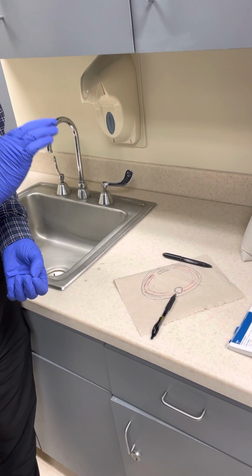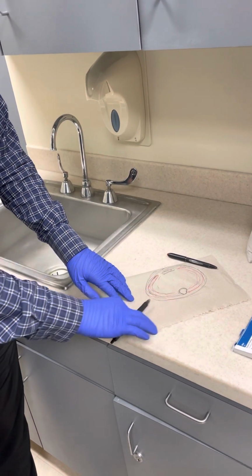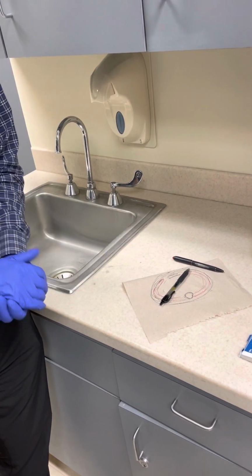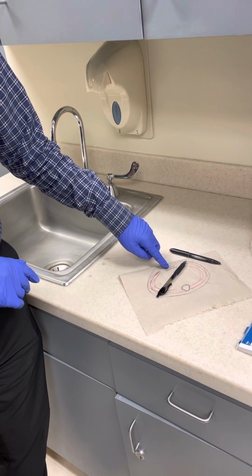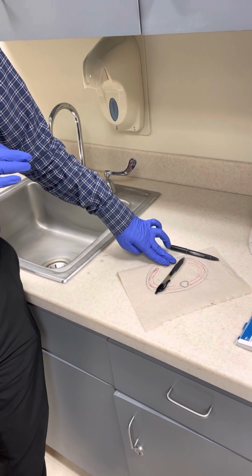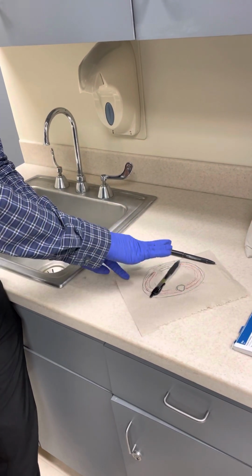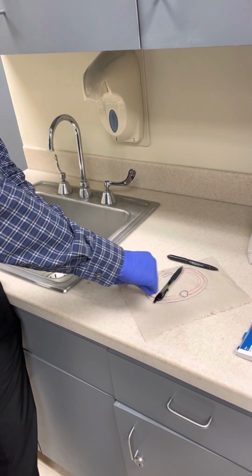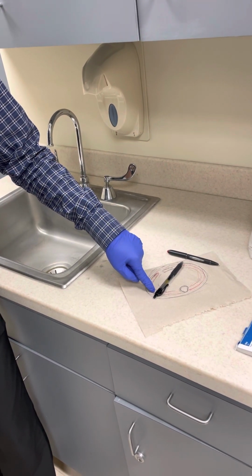It makes no sense for you to try and do this for the right ribs because the spine will be on top. But if the x-rays were coming through like this, now we see the ribs without this superimposition. Does that make sense? Sternum's really thin, it doesn't really show up unless you force it to show up. So sternum doesn't matter, right? It might as well not be here. And so you can see all these left ribs without superimposition. You elongate them nicely, you see the size of them. Right? So an RAO is used to look at the left ribs.